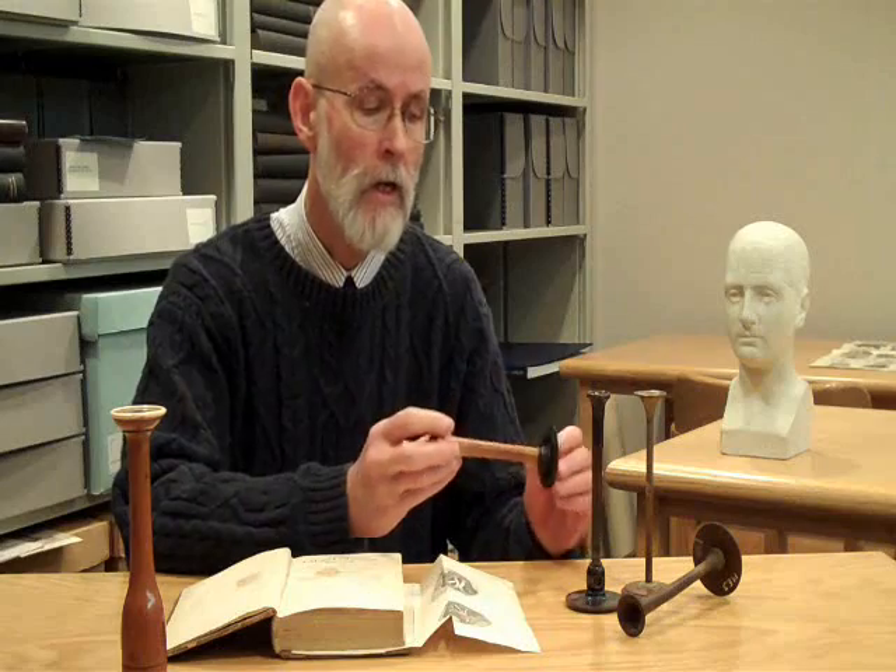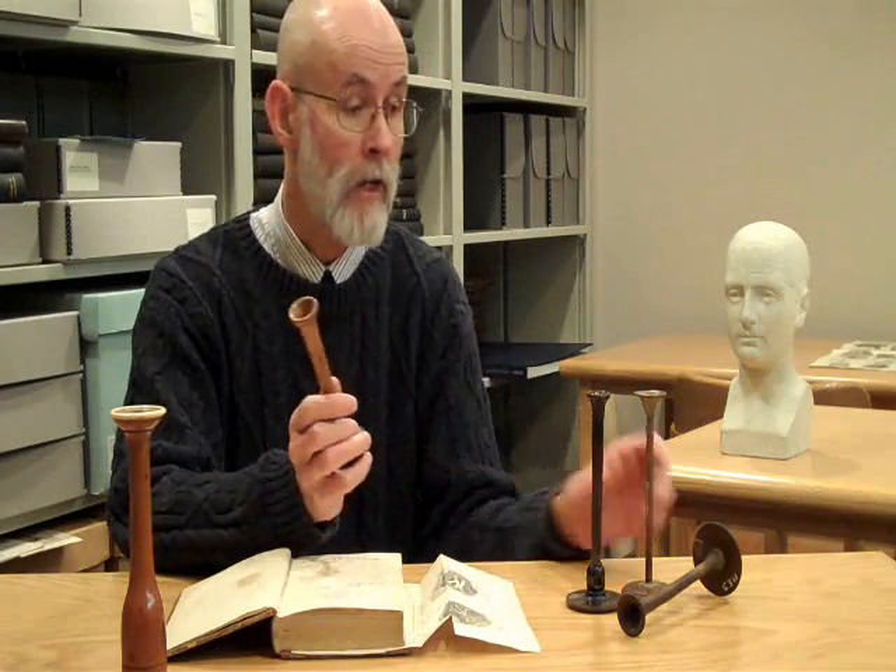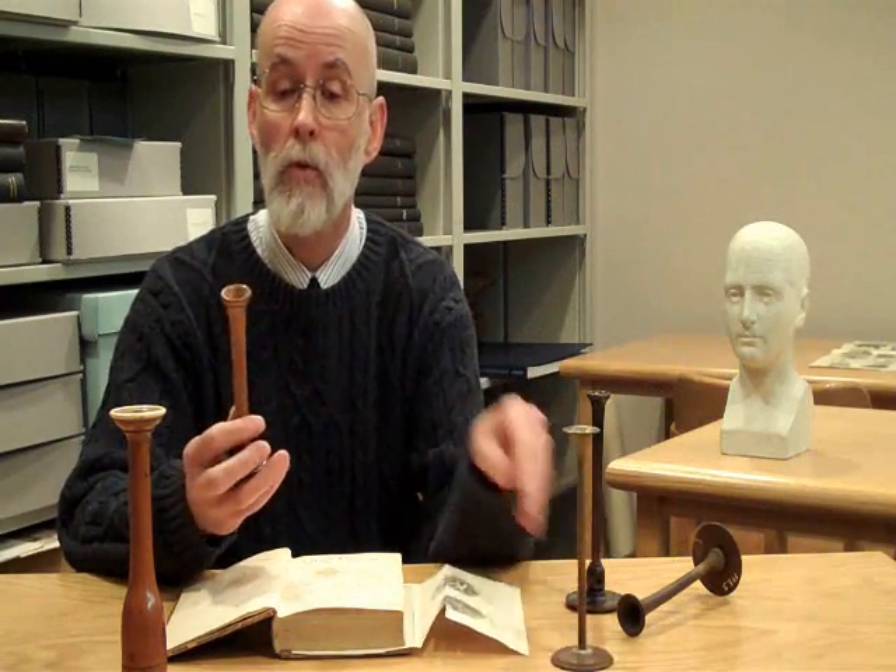These four instruments you see here are probably from the 1840s to the 1850s. They can be made of metal, or they could be made of wood, or they might be made of animal substances such as horn. The broad end is applied to the patient's chest, the small end to the physician's ear.